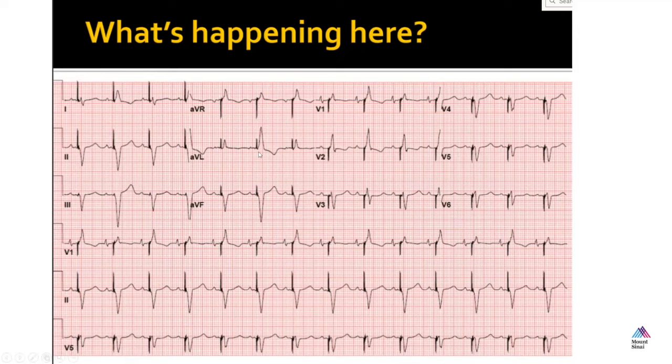The way the pacemaker is programmed is you basically tell the pacemaker, let's say 110 milliseconds after a sensed atrial event, I want you to pace the ventricle. And so what could be happening is that because the ventricular lead is so apical, it doesn't actually sense the depolarization of the ventricle because the impulse from the AV node down to the apex of the right ventricle hasn't yet happened. And so it's pacing basically on top of a depolarizing ventricle from the AV conduction.